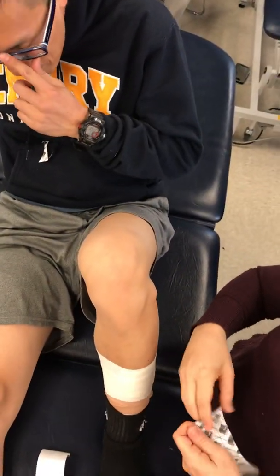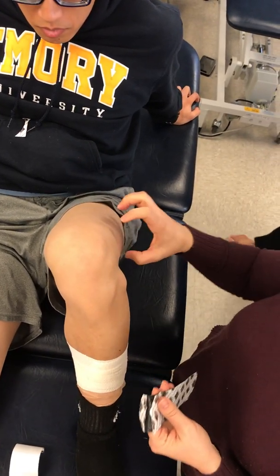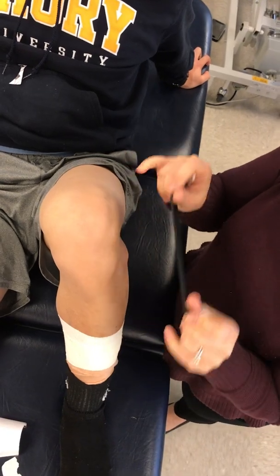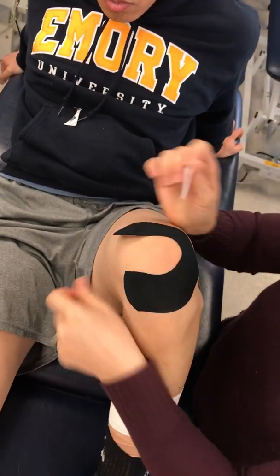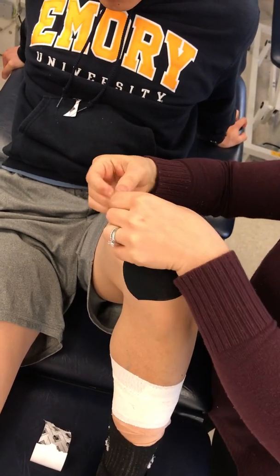The other concept you might want is, if you know it's specifically laterally tracking, and that's the big problem, that it goes laterally through more tightness or force through the VL. You can do the horseshoe coming at the patella this way. You'll see right where the patella is, come right at it, full stretch, come right at it, give it a push, and then you're going to do it like that. These are your blocking techniques, okay? These are your mechanical blocking techniques for knee pain.